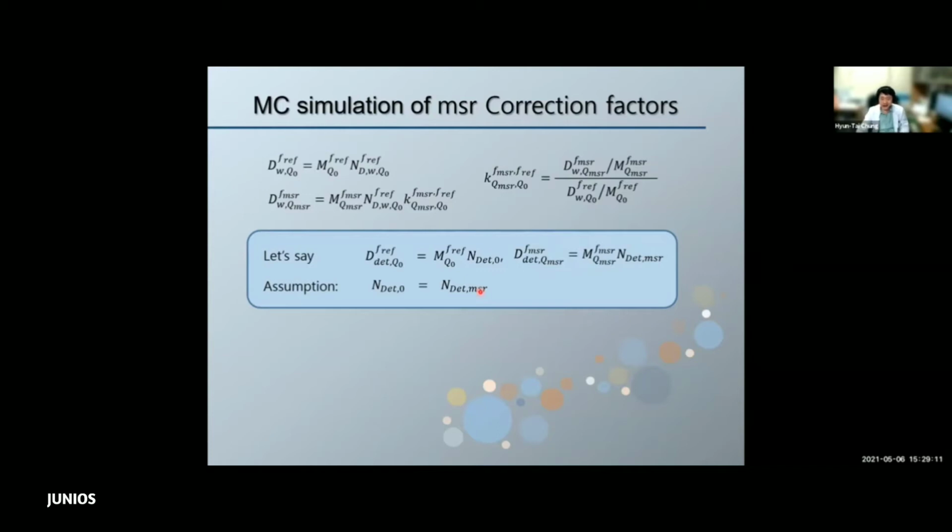It is very natural. The absorbed dose to the detector and output charge from the detector are always proportional. And this assumption says that the proportional coefficient is constant. It should be. That's the detector characteristic. Otherwise, we cannot say it is a detector. So this is a very natural assumption.